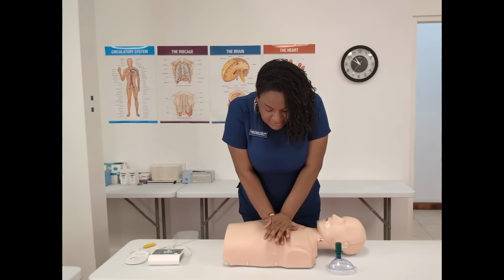Lock your elbows. When you compress deeply enough, which is 2 inches for our mannequins, you're going to hear a click. On a human, you're going to feel resistance, and that resistance is a rib, or unfortunately the breastbone. We may have to sacrifice this breastbone right now in order to get to the heart. That's the body's natural protective mechanism. We have the rib cage and the sternum there for a reason.